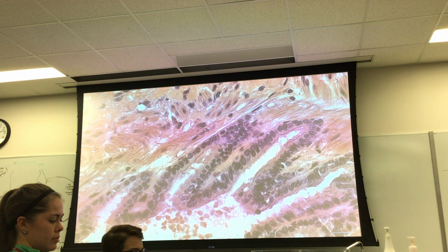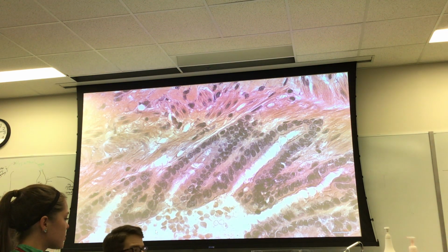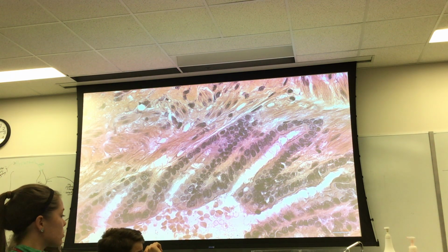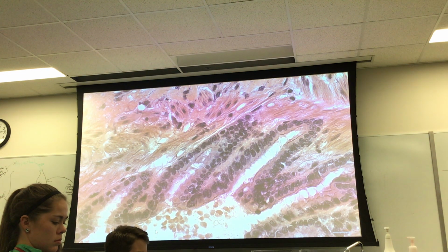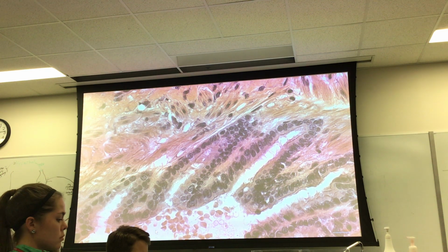Now, hi Neil. If you are completely confused, and hopefully you aren't, remember this. There's only 4 tissue types, so it's got to be one of them: nerve, muscle, epithelia, connective. Which one is this? It's a lumen, remember, a body surface, so it's got to be an epithelium. So good, we've narrowed it down. It's not muscle or nerve, it's not connective tissue, it is an epithelium.